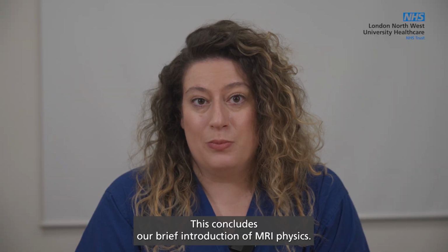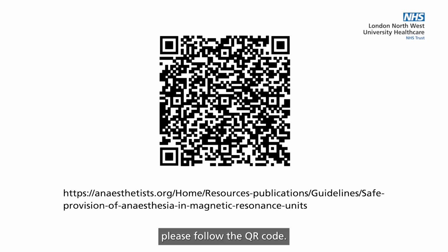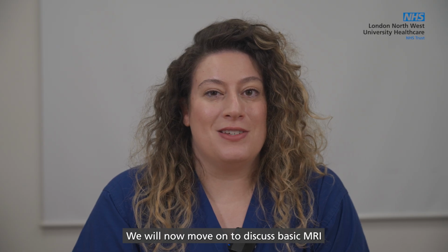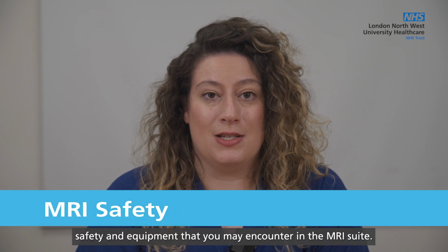This concludes our brief introduction of MRI physics. If you would like to read more about the science behind MRI scans, please follow the QR code. We will now move on to discuss basic MRI safety and equipment that you may encounter in the MRI suite.